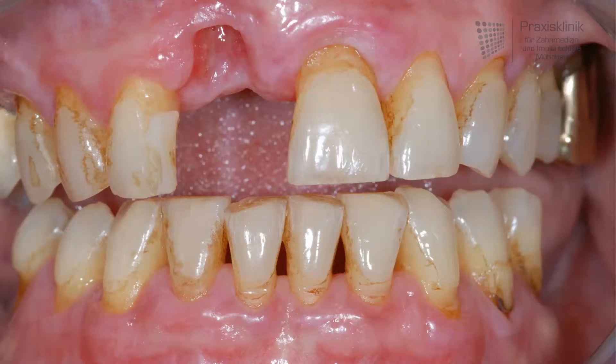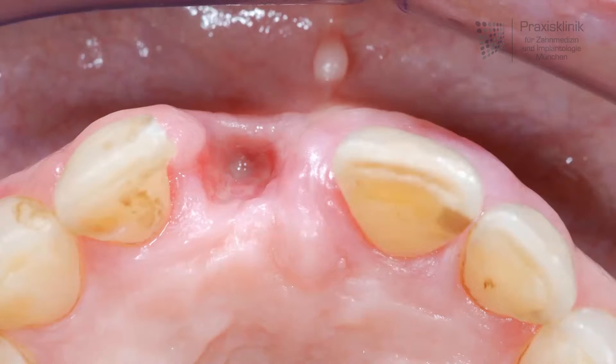With regard to implant therapy, it is very important to restore first the bone of the jaw and after that to have sufficient soft tissue around this bone to provide a natural and aesthetic result. In the top view we can see we have a three-dimensional defect with a massive loss of volume of hard and soft tissue.